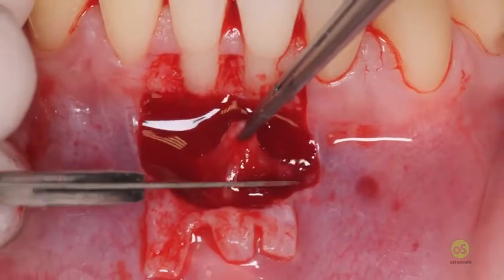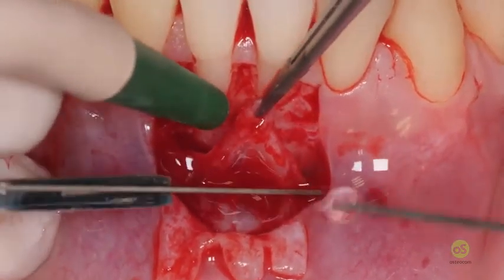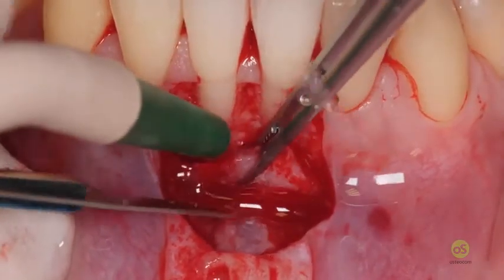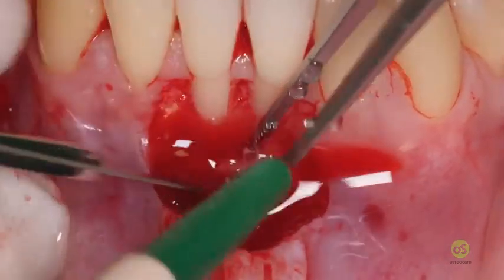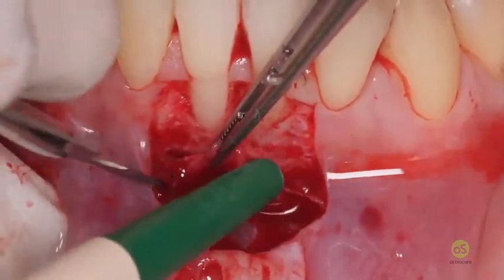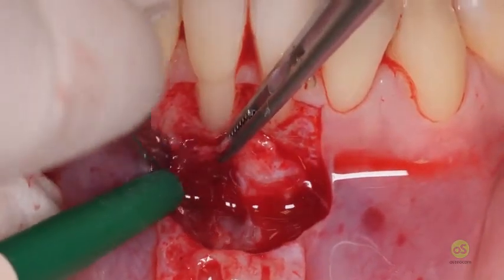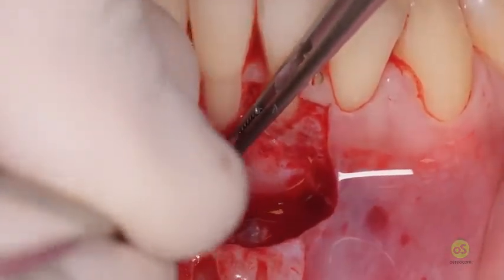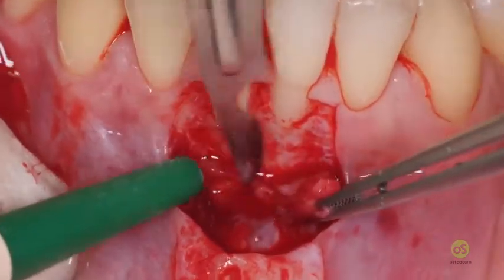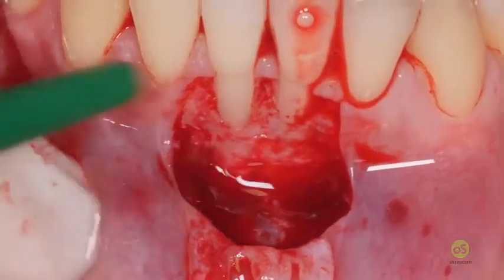This area of muscles that was previously attached to the periosteum is physically removed by connecting the most superficial aspect of your superficial incision to the deepest aspect of the deep incision, so the whole area of 5 millimeters of periosteum apical to the root exposure is completely free.